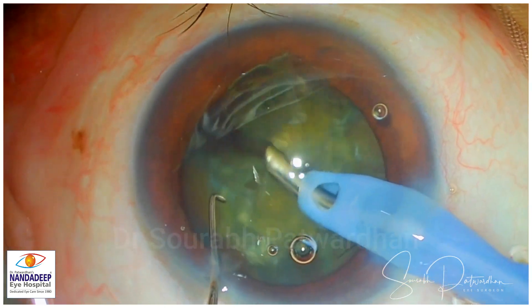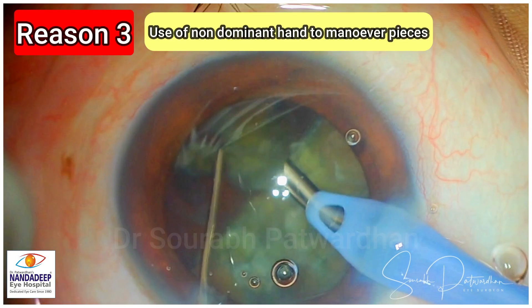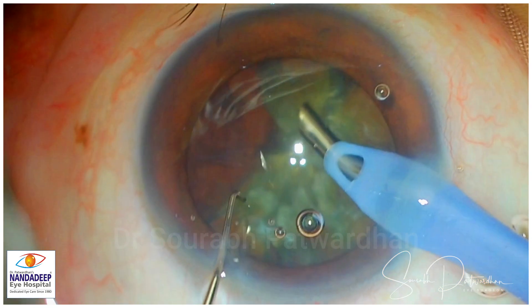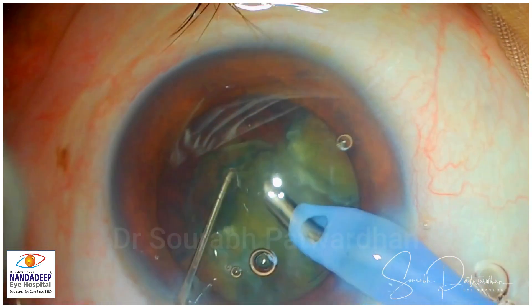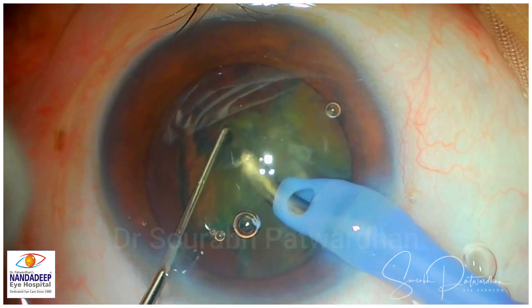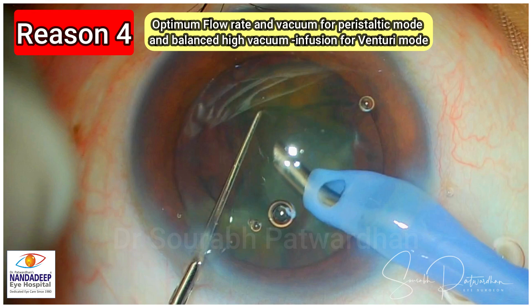Good fluidics are required to keep the posterior capsule safe in this position. Always use the non-dominant hand — you can see throughout the surgery that the non-dominant hand of the surgeon is moving the pieces around the phaco tip while the phaco tip is holding its position most of the time near the center of the eye. Train your non-dominant hand to move the pieces.